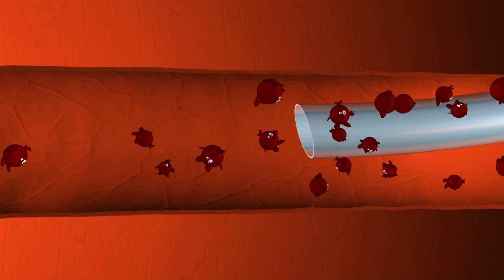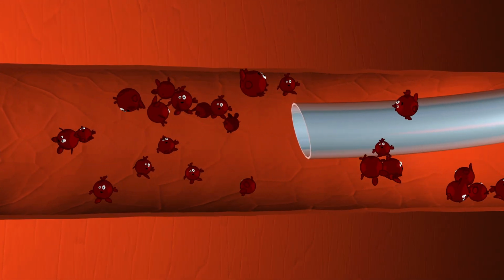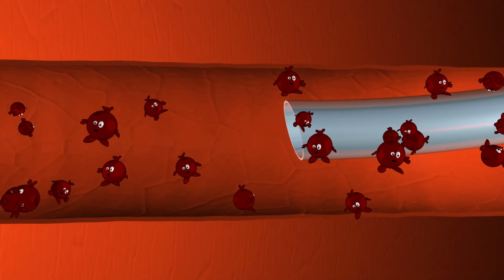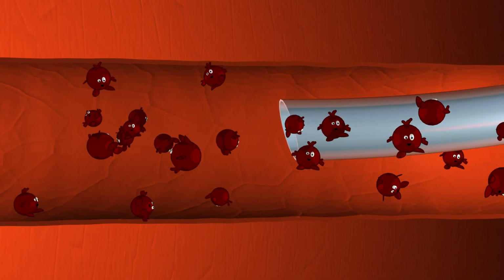Vascular access devices have a tube-like structure whereby the internal volume and the vessel in which it sits must remain patent to the flow of blood and fluid in both directions.